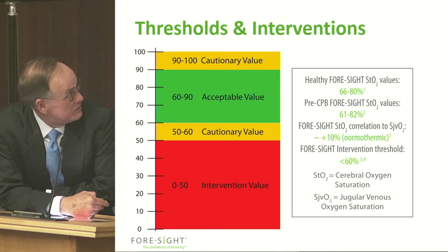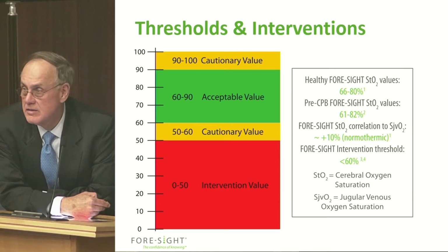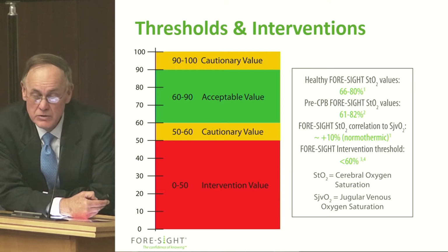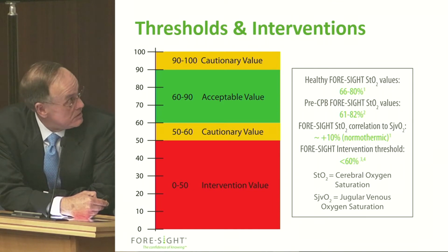Any saturation between 60 and 90 is considered normal. You wouldn't have to treat that at all. There are two cautionary values.